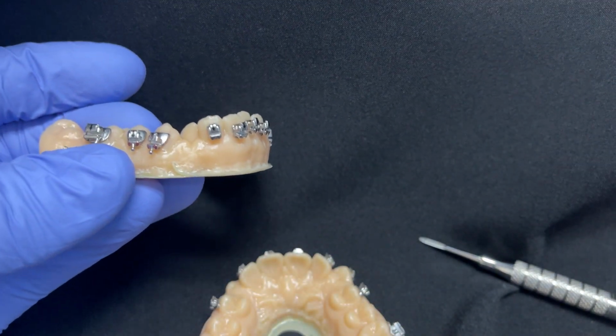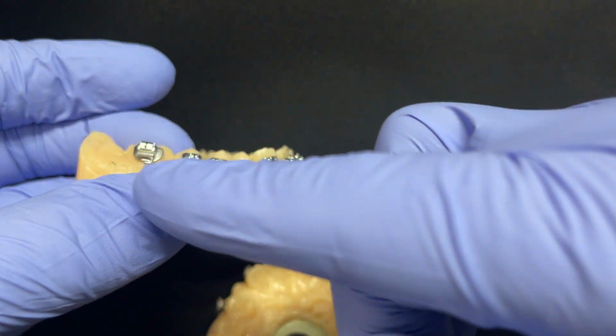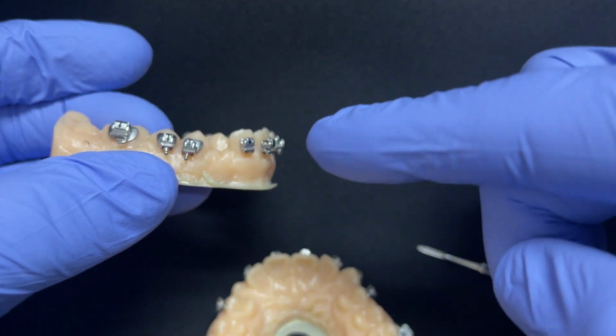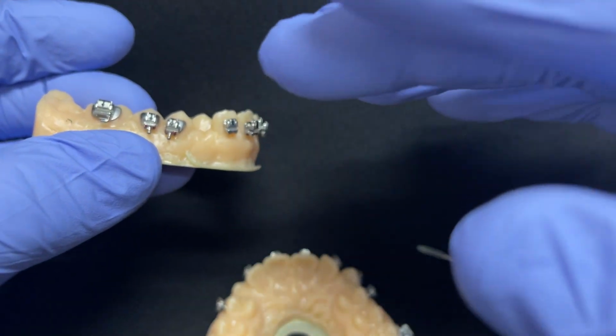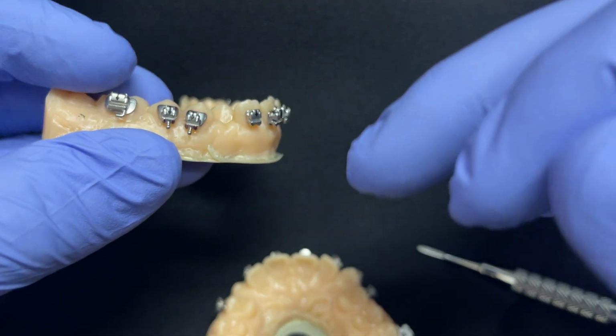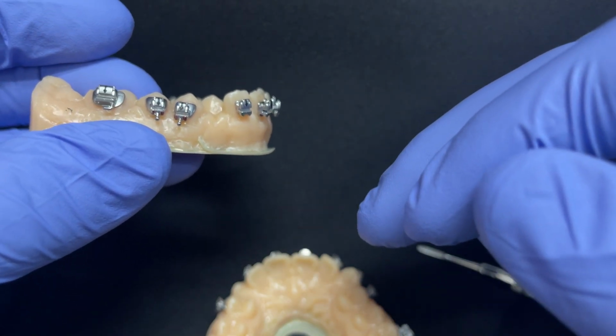But the point I want to get across here is that on deep bite cases, I want to build in this accentuated curve of Spee so that when our wire goes in there, that wire wants to level out. It's going to extrude these premolars, it's going to intrude the molars and the incisors, and that's going to help open up the deep bite.